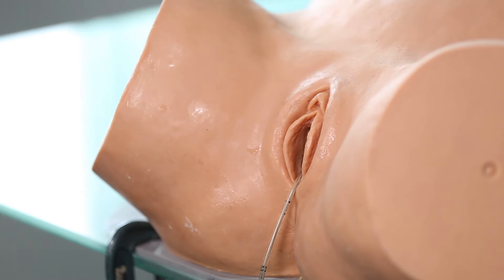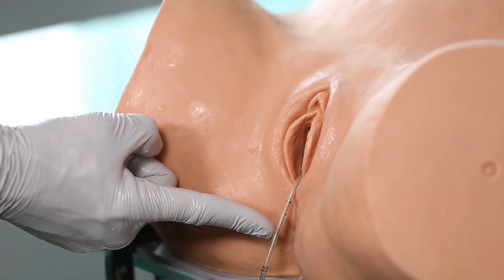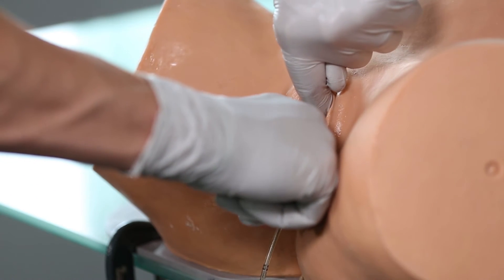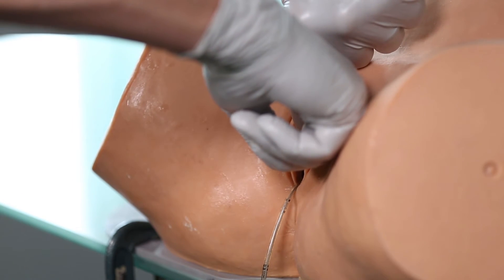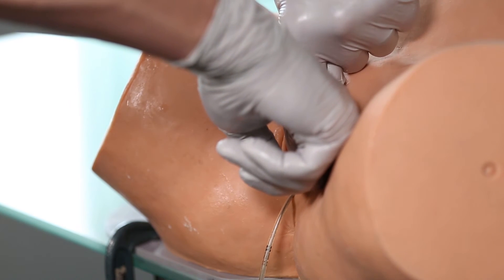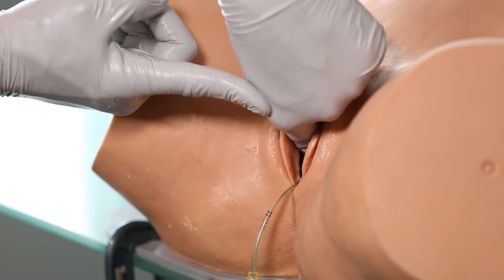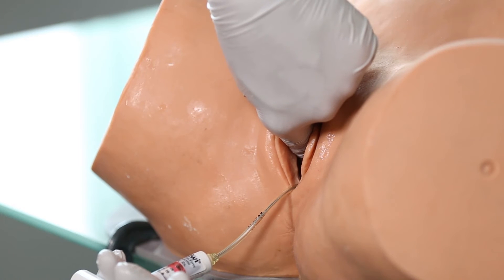Step number three is to maneuver the cup to the predetermined distance, which in this baby was eight centimeters. I insert two index fingers — the superior hand holding tissue up and out of the way, the inferior hand right on top of the edge of the cup and pushing downwards. As I push down, you can see the stem shortening. I'm now at the six centimeter mark and I continue to push — there's seven centimeters, and there's eight centimeters. I then stabilize the cup with my superior hand and use the other hand to establish vacuum.